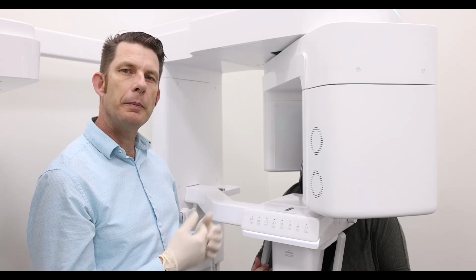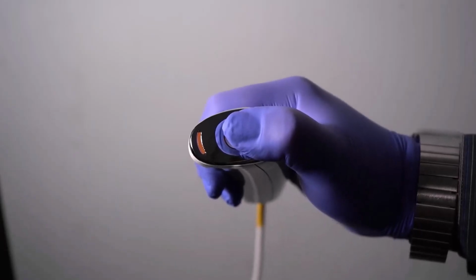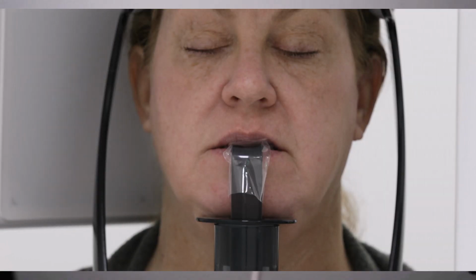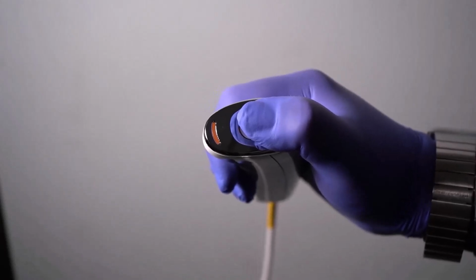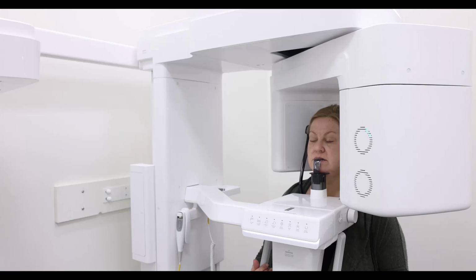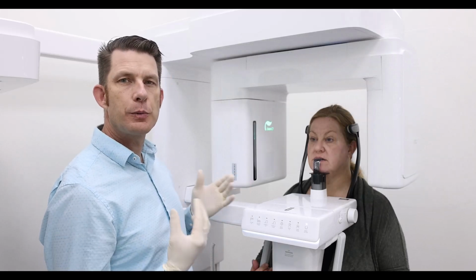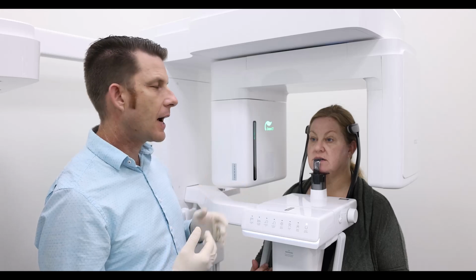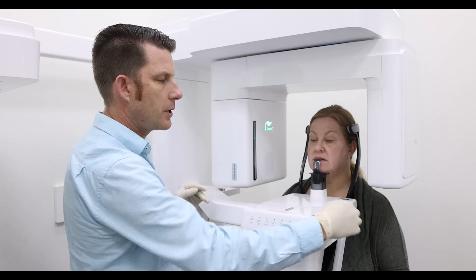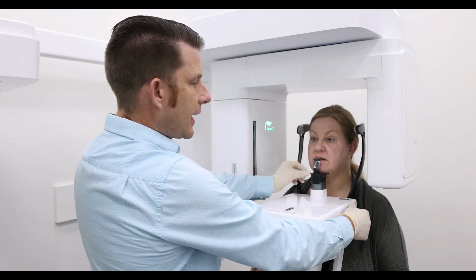Go ahead and step out of the room and capture our image. Hold the button on the acquisition trigger switch, which will turn yellow when exposing. Hold the button until the image acquisition is fully complete. Image capturing is complete. Please wait a moment. Once capture is complete, the device will have the patient open their eyes. The instructions I provided to the patient is I'm going to go ahead and open the temple supports and have them go ahead and step back and out of the device.